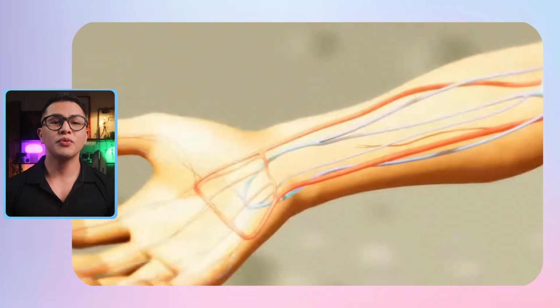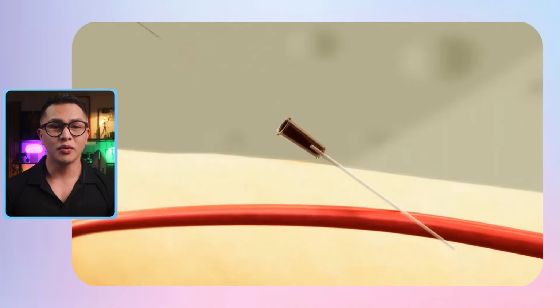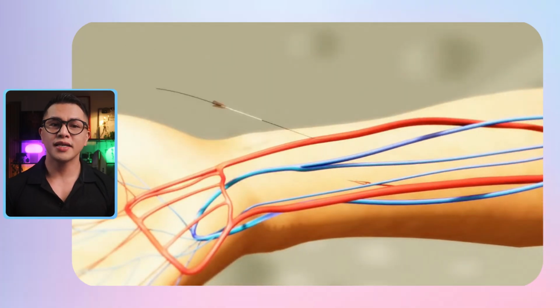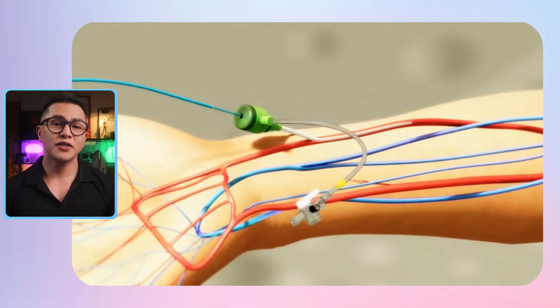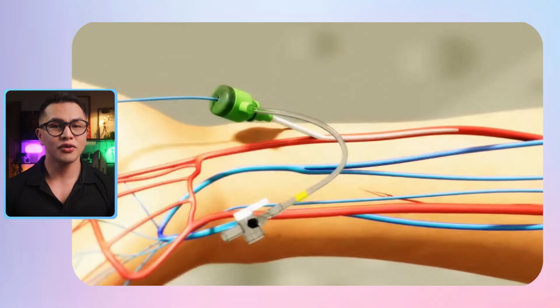Here's the technique that most people get wrong. You need to withdraw and discard 3 times the dead space volume of your arterial line. For most systems, that's about 5 to 6 ml. This eliminates contamination from the flush solution.